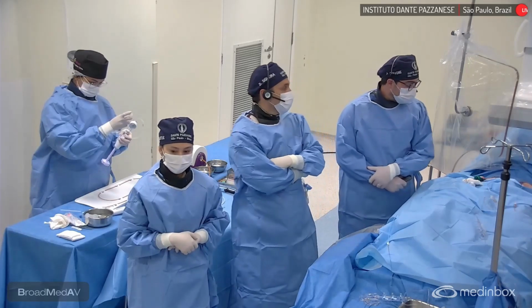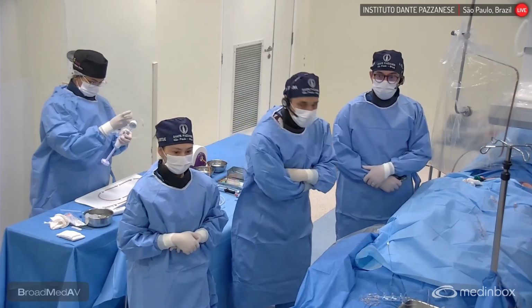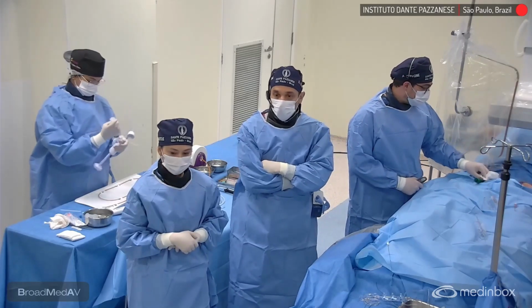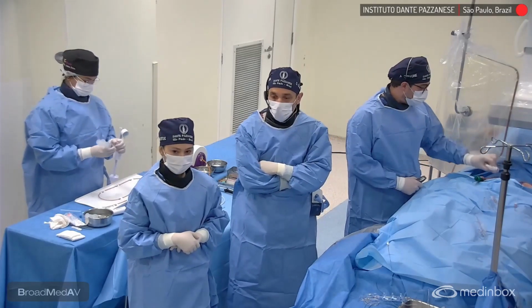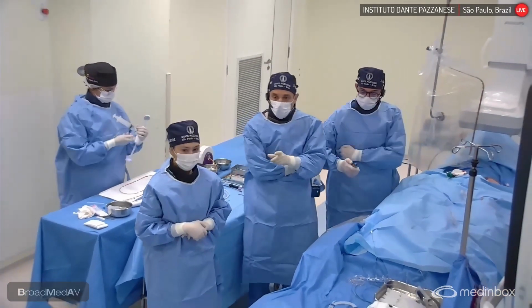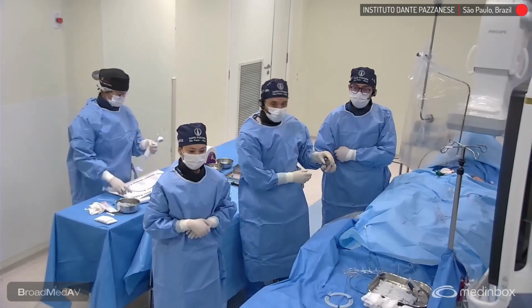We have a team here from echo and from anesthesia. And without further ado, I would like to show to you the case that we have for today. May I have the first slide, please?